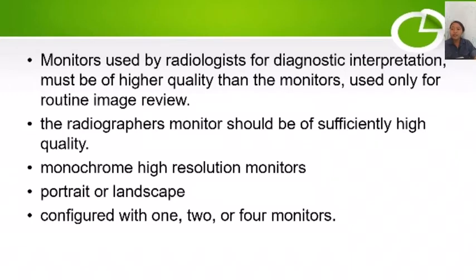Monitors used by radiologists for diagnostic interpretation, referred to as primary, must be of higher quality than the monitors used only for routine image review. However, the radiographer's monitor should be of sufficiently high quality in order to discern all the image quality characteristics accurately before sending the image to the radiologist for diagnostic interpretation.